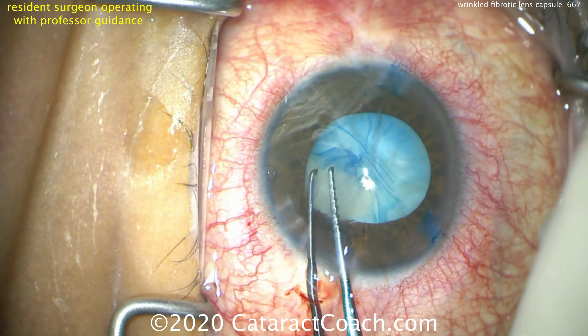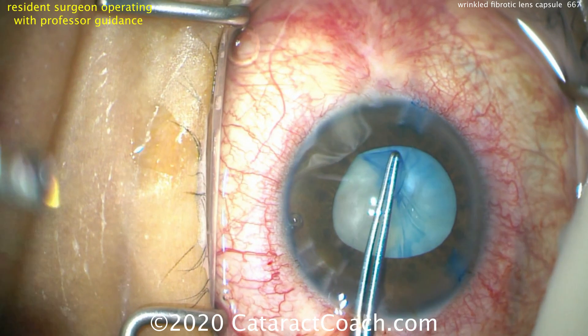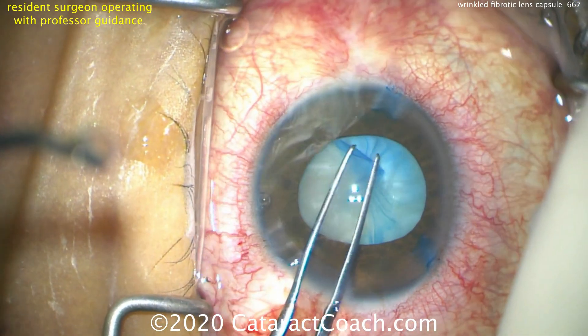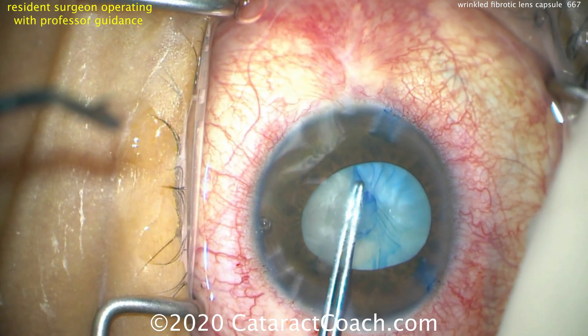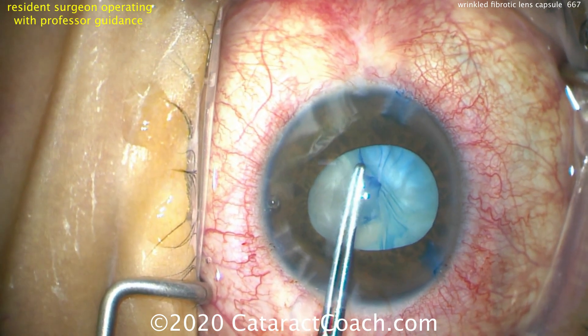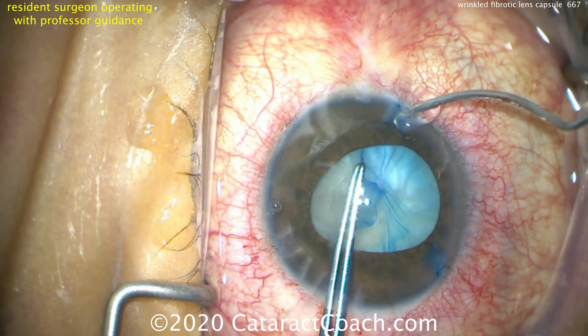Make the capsulorhexis large in order to encompass those central wrinkles. Also watch carefully — is there zonular laxity? In this case, luckily there's not. Sometimes zonular laxity can lead to a wrinkled anterior lens capsule, but in this case it's just fibrotic. There's a traumatic cataract and luckily the zonules look reasonable.